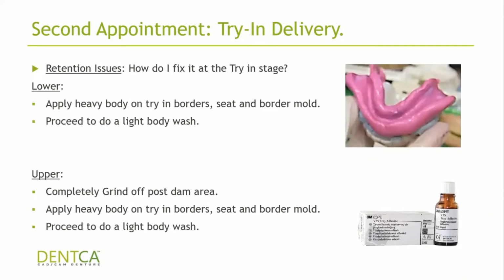If you're doing an upper, it's also very important that you grind the post-dam area before you do a wash. Otherwise, that post-dam area is going to be copied when we scan it and when you design it, and you don't want the software to create another post-dam on top of the existing post-dam. So it's always recommended to grind that off. If you didn't grind it, there are ways around it. During the software, we can request for it not to create a post-dam, but it's always better to just remove the post-dam when you do the wash.